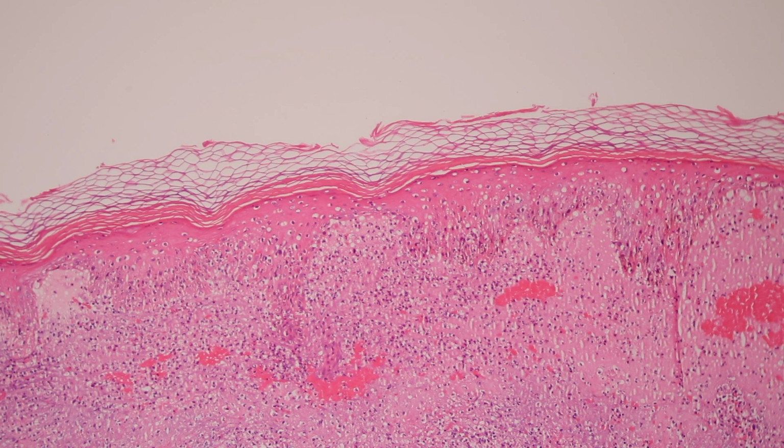So anytime you see that change in the epidermis, you have to think something is blocking blood flow to the epidermis. And then you need to go find out, is it because there's vasculitis underneath? Is it because there's thrombi in the vessels? Is it calciphylaxis? Is there some other reason that the person has ischemia? So this is a good general pattern in DermPath.